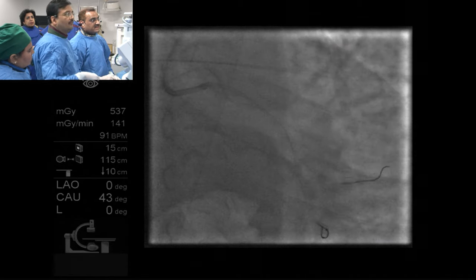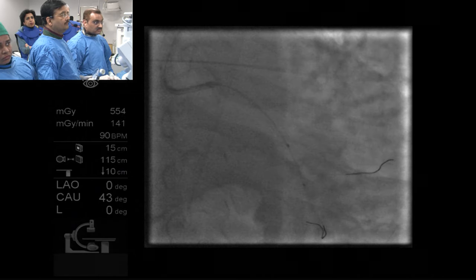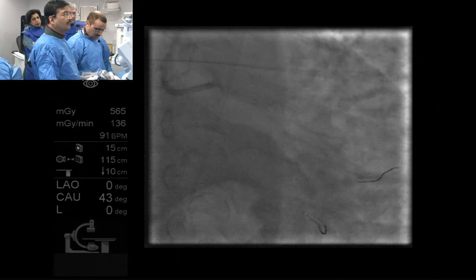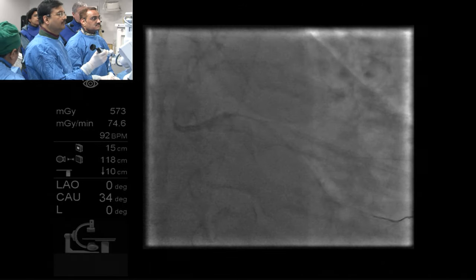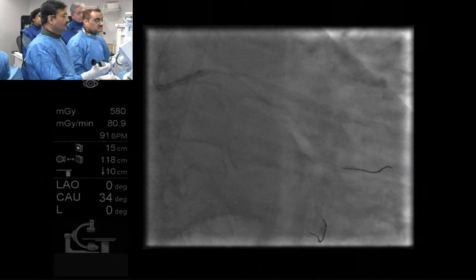Can you tell us what you're doing now? I'm trying to advance the stent, but the stent will not go there. Where's the stent? You see it in the guide? That's a balloon. It's coming out. No, that's a balloon. This is a balloon. Right, in 6 French. It was NC Trek. Yeah. This is a 6 French guide. Yes. And as Raji suggested yesterday, why don't we do 7 French if we know we have to do bifurcation stenting?